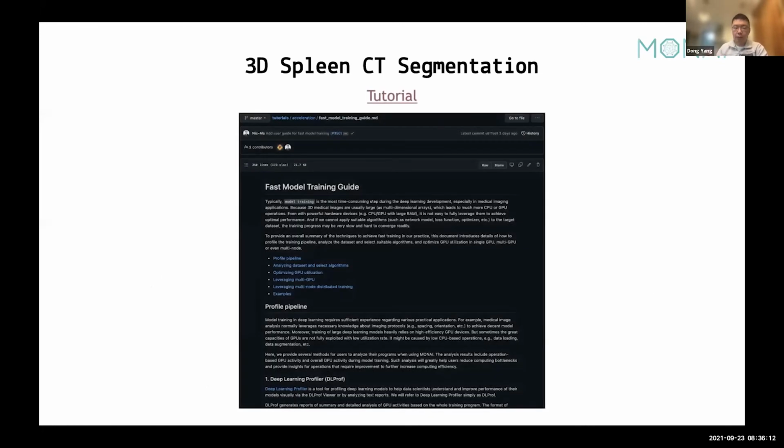And for this final solution, as I just said, we have made it available online in the tutorial. So let me click it on.